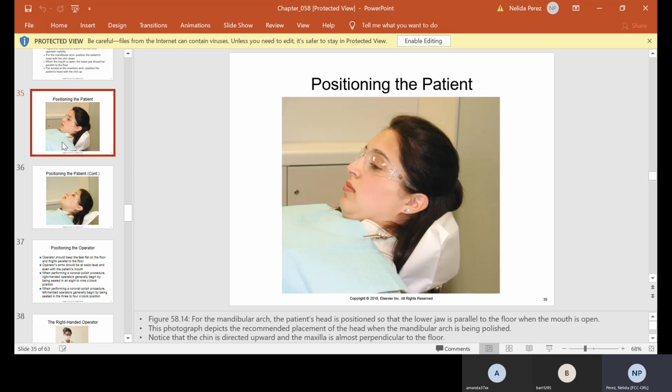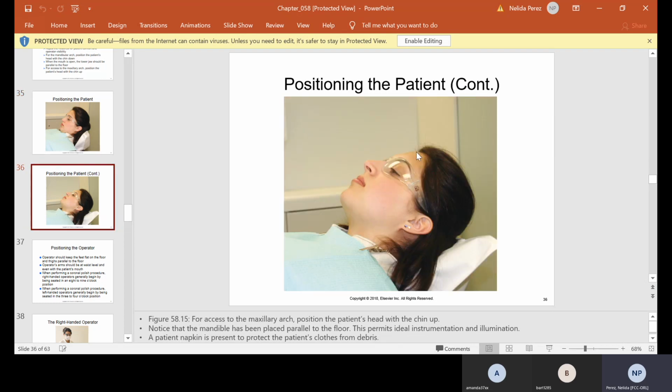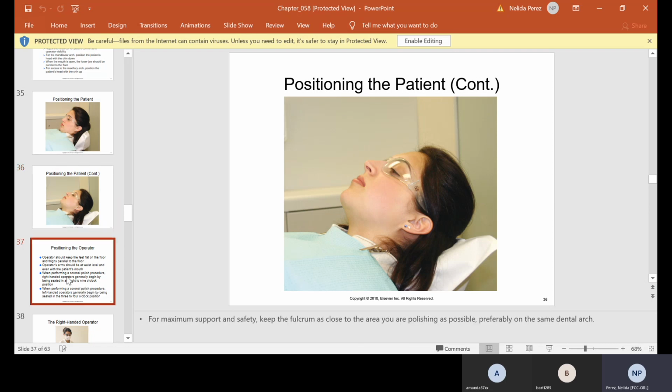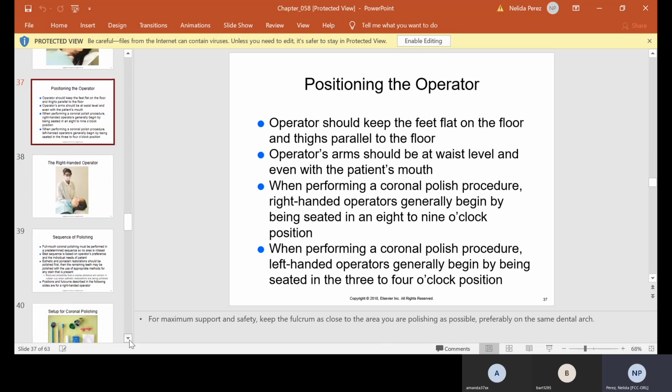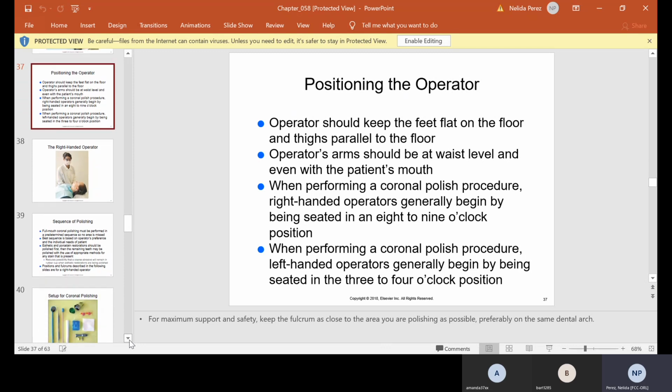So, if you're working on the lower, you have their head facing down. And if you're working on the upper, you have their head facing up. It's easier for you to see that way. And again, you keep positioning until you're comfortable. Don't strain your back or your neck, because at the end of the day, you're going to have a back and neck ache. Positioning the operator should keep the feet flat on the floor and thighs parallel to the floor.